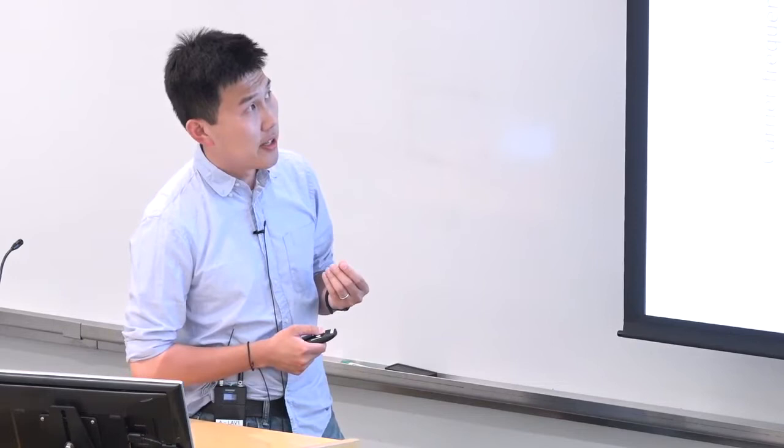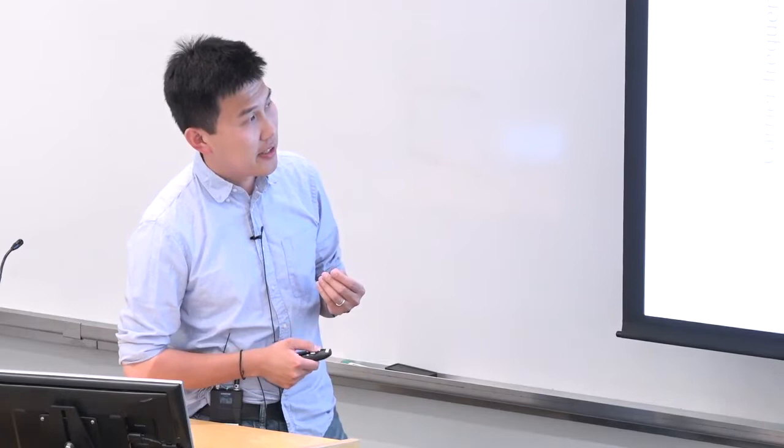So they may sound something like this. So this is the left stream when the pattern of the melody is going up and stays there. And for the other stream, it's shorter, so it feels quicker, and it has lower carrier frequency. And the carrier frequency actually goes up and comes back. So it's a zigzag pattern. And I can play them together.